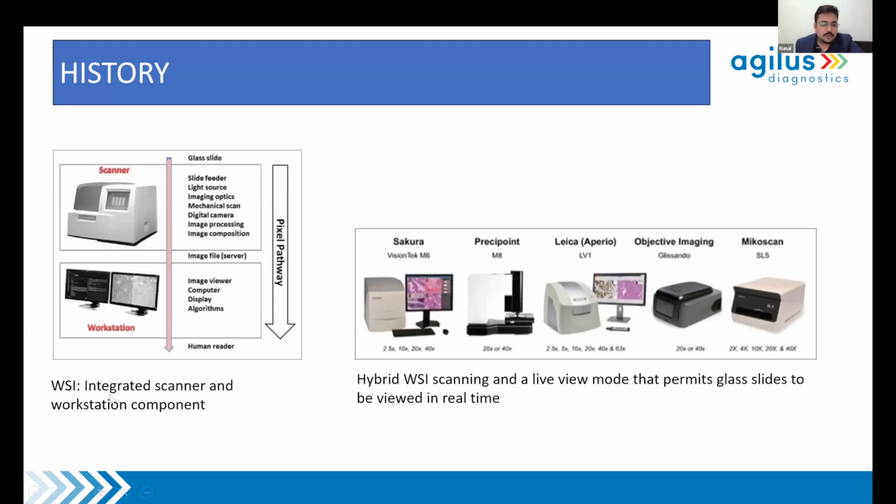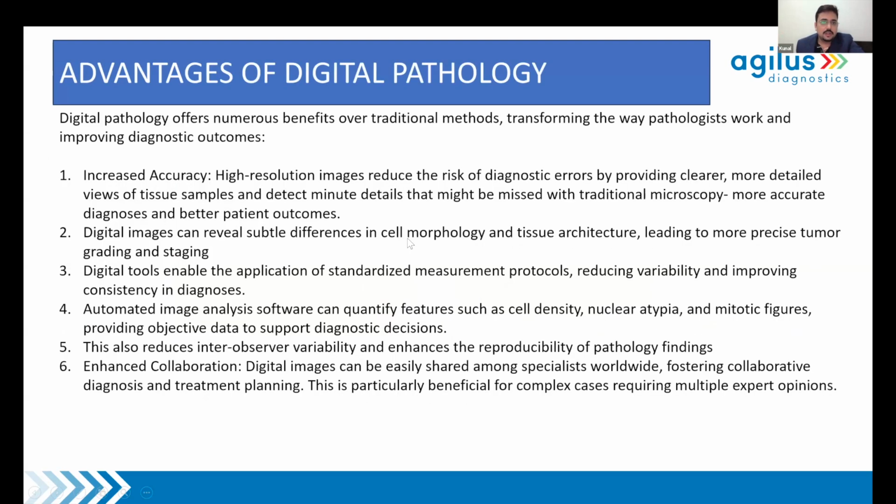So this is just your regular scanner, which consists of the scanner and the workstation. The scanner is where the slides are scanned, and the workstation is the computer which displays these slides. And we could have a variety of algorithms. Also, the new age scanners, which are the hybrid WSIs, which capture live mode scannings, thereby intraoperative consultations are also a reality today.